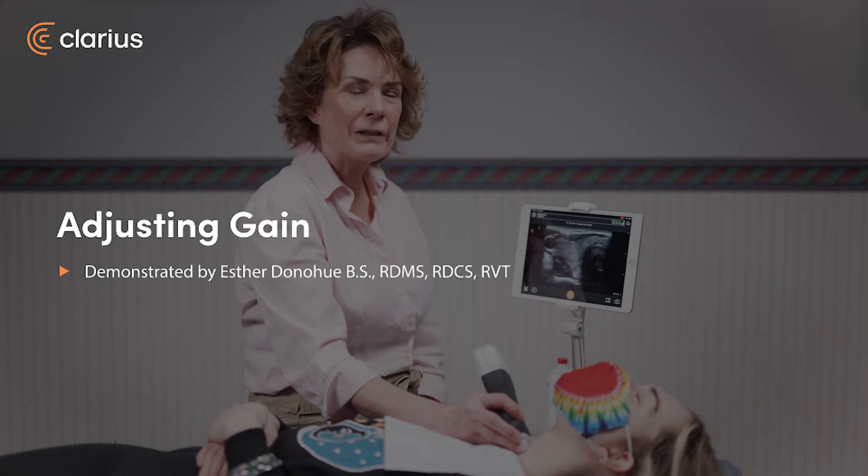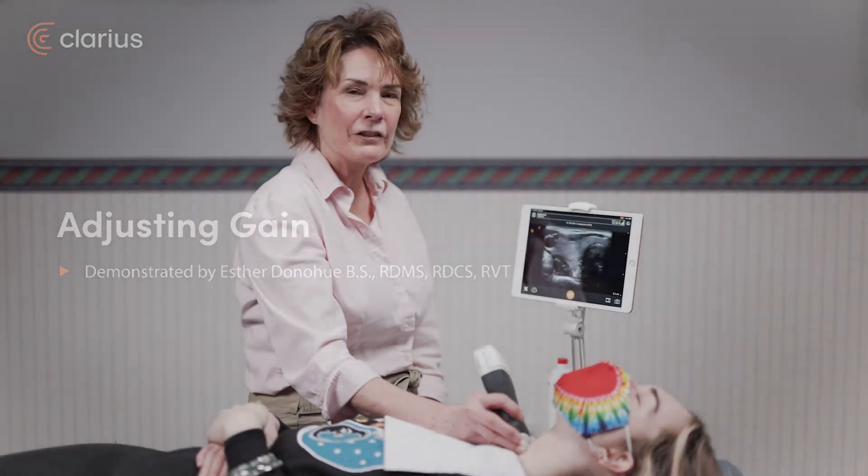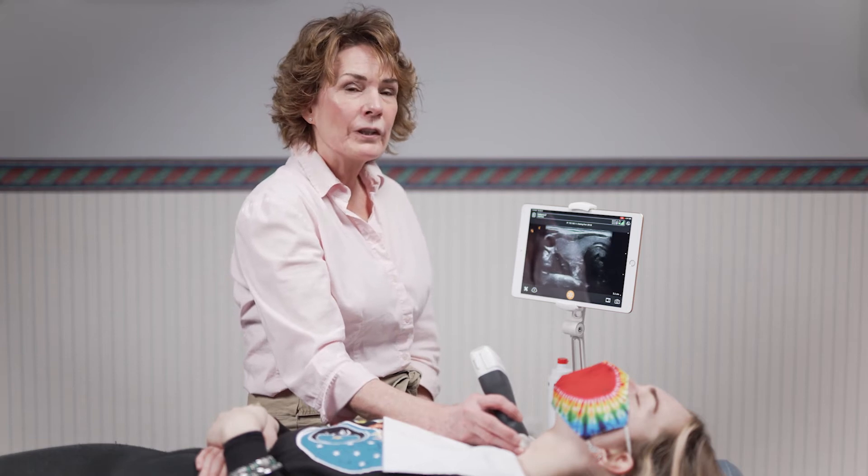Hi, my name is Esther and I'm going to be showing you today how to change the gain on your Claria scanner. It's important to have the correct gain, otherwise you could cover up information or miss information.